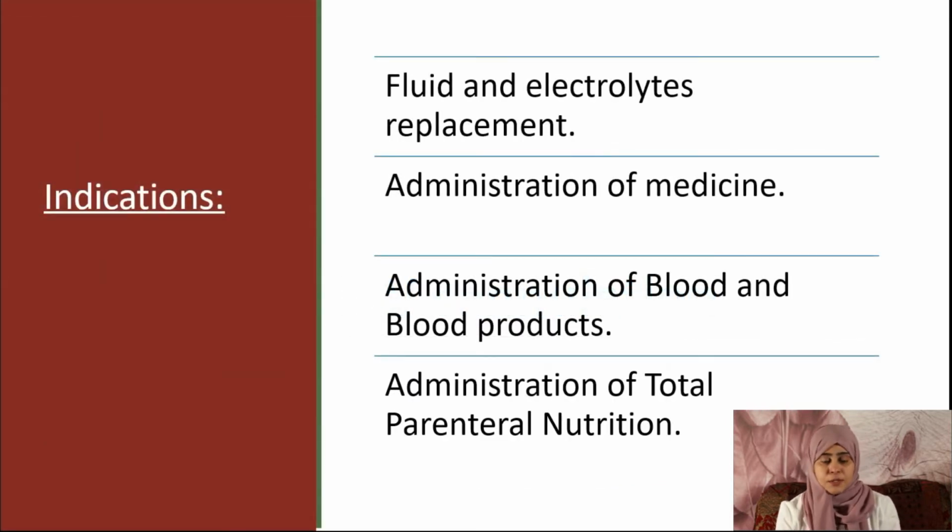First, the indications. We will need IV access for fluid and electrolyte replacement, administration of medication, administration of blood and blood products, and administration of total parenteral nutrition.